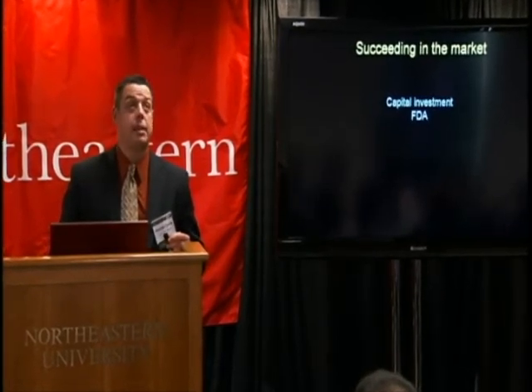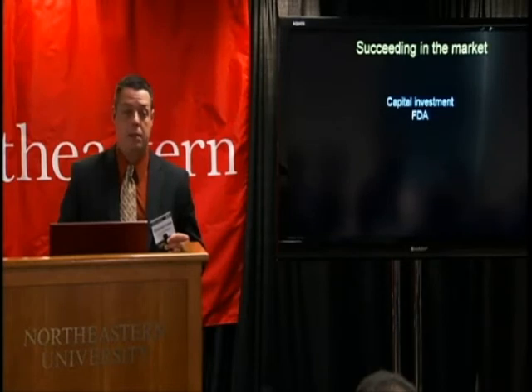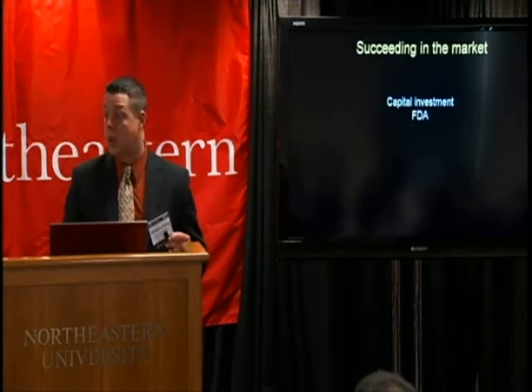Some of the papers that Milind referenced were done under that contraindication. Back in 2008 we went through our 510K process with the FDA. It took us about 8 months, and we received a new intended use statement from the FDA that now does allow confocal images to be used as a primary means of diagnosis, so that the physician can use confocal images alone and render a diagnosis based on those images.